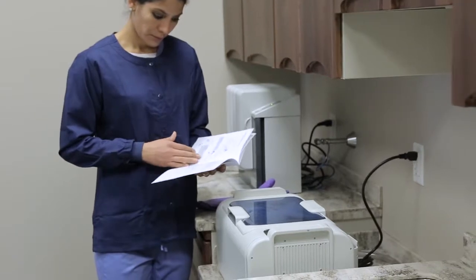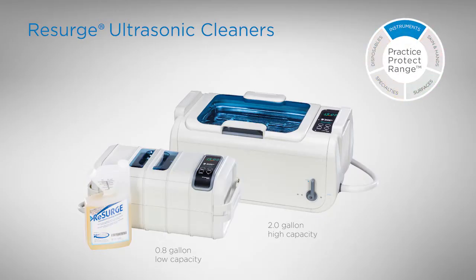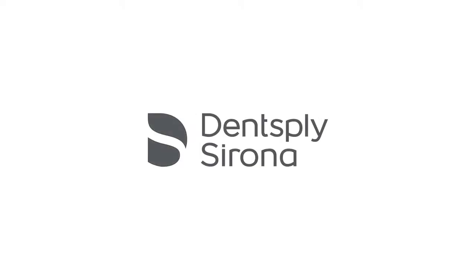Should you have any questions about the use of the ultrasonic cleaner, consult the instructions for use. Experience the confidence of better, safer, faster instrument reprocessing with the Resurge Ultrasonic Cleaning System.